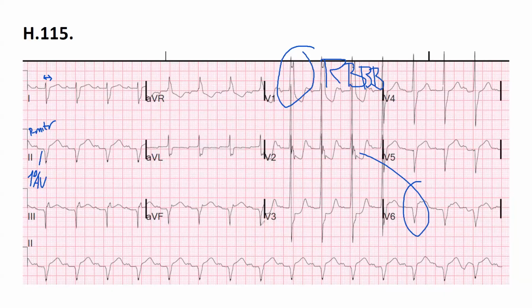Yes, I will. And axis. Negative, right deviation, okay? Well, let's see, because AVF is negative, both negative. So if you do have negativity, you are somewhere here. That means the extreme right deviation, okay? That can be, for example, a left posterior hemiblock.